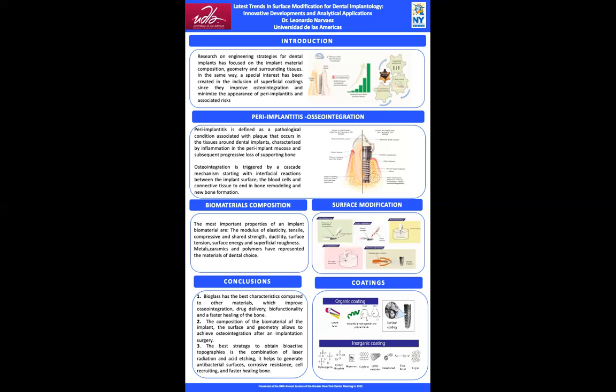The second one is osseointegration. It's triggered by a cascade mechanism starting with interfacial reactions between the implant surface, the blood cell, and connective tissue to end in the formation of new bone.